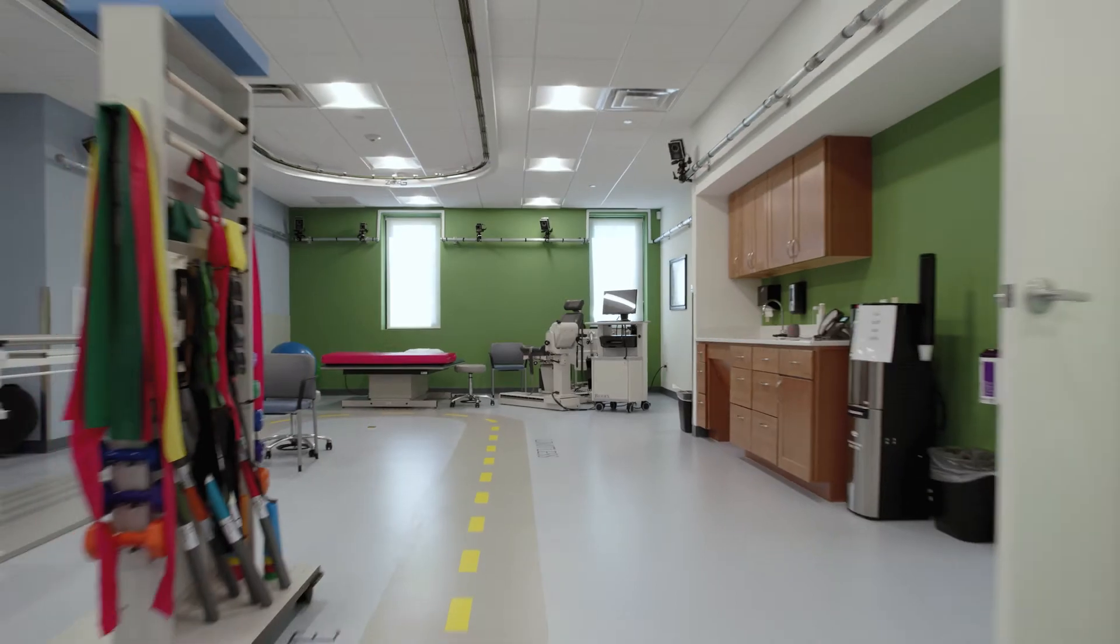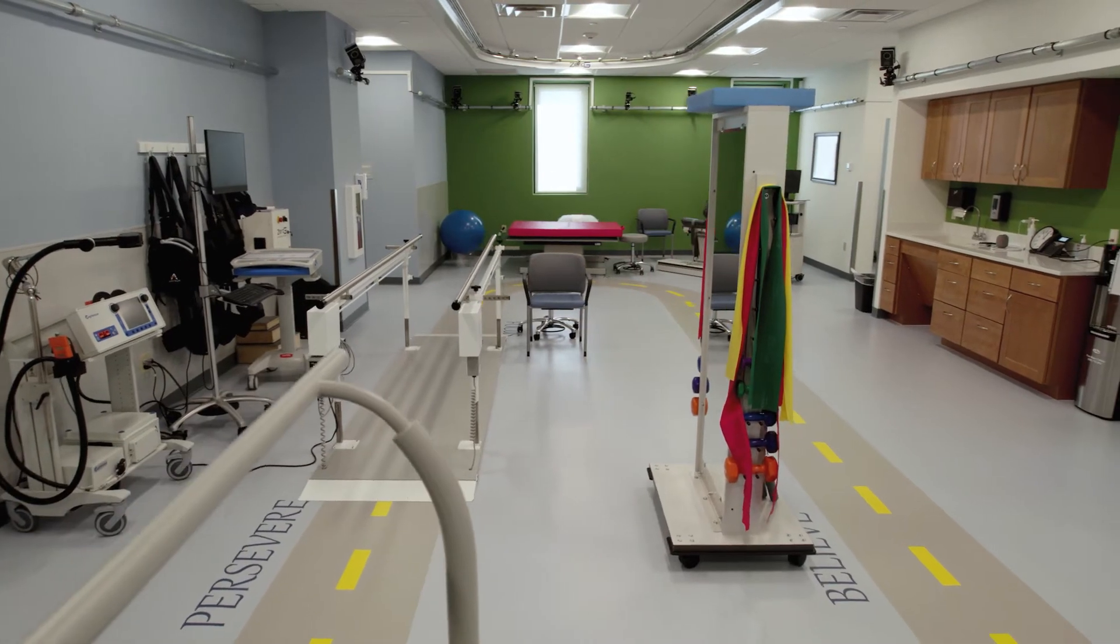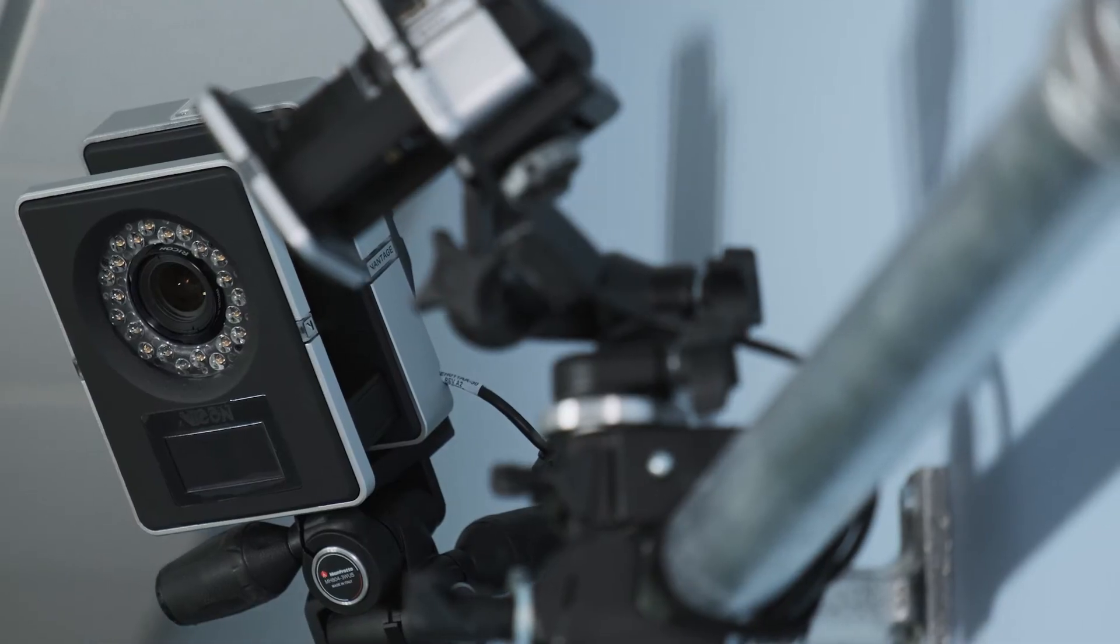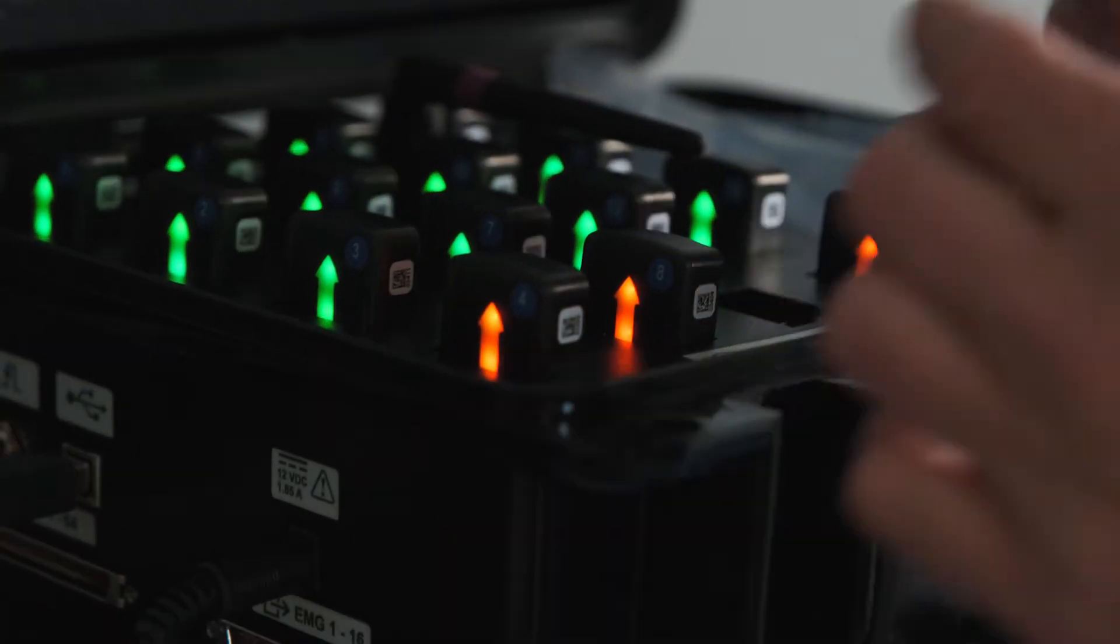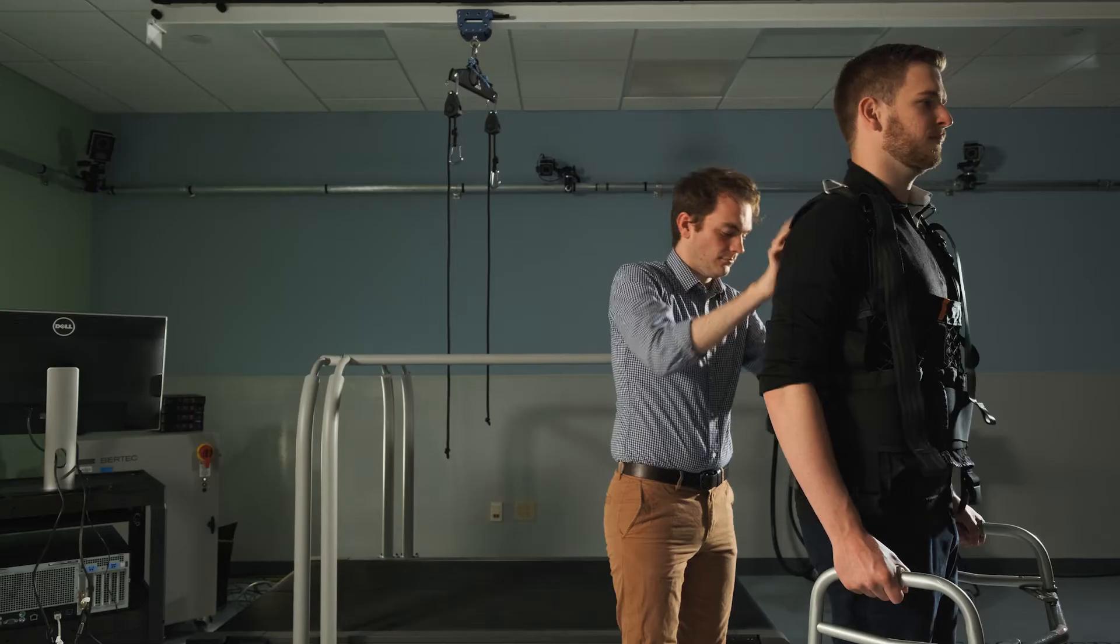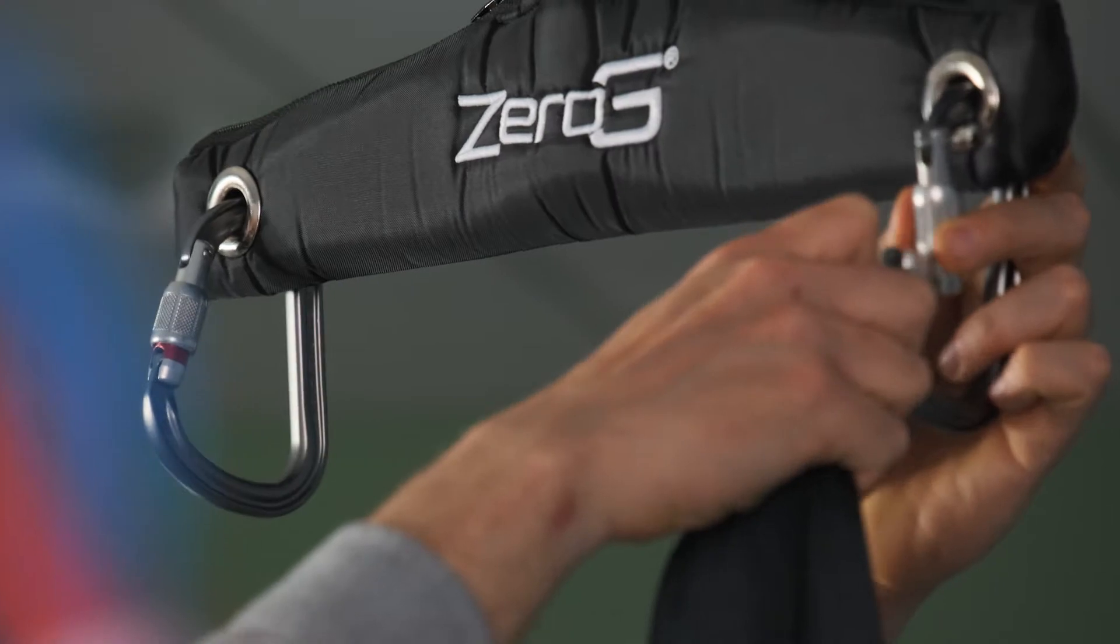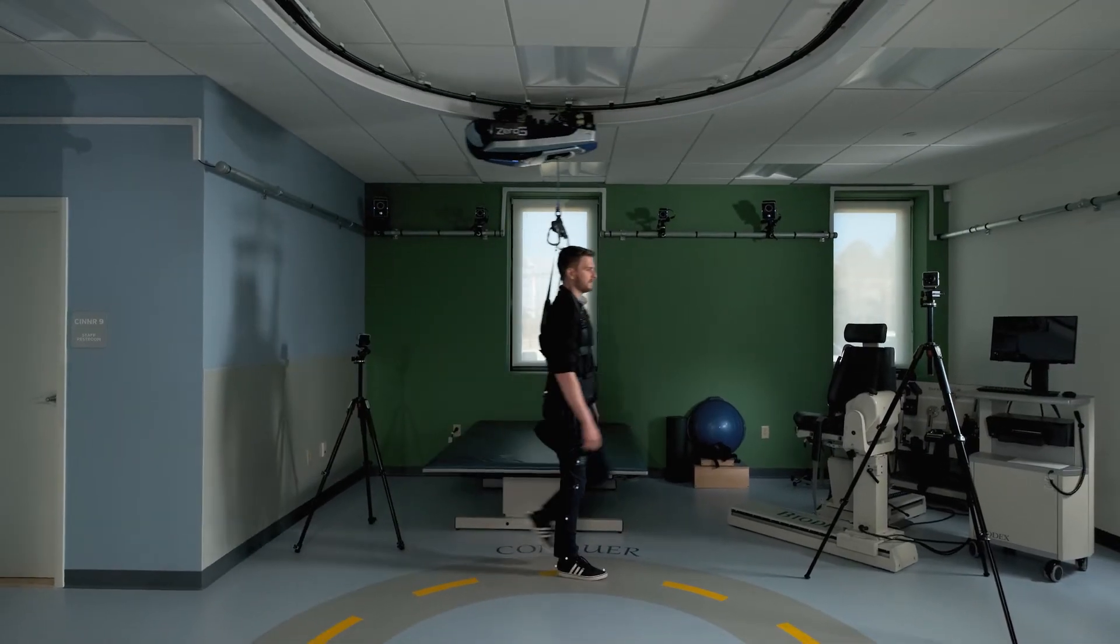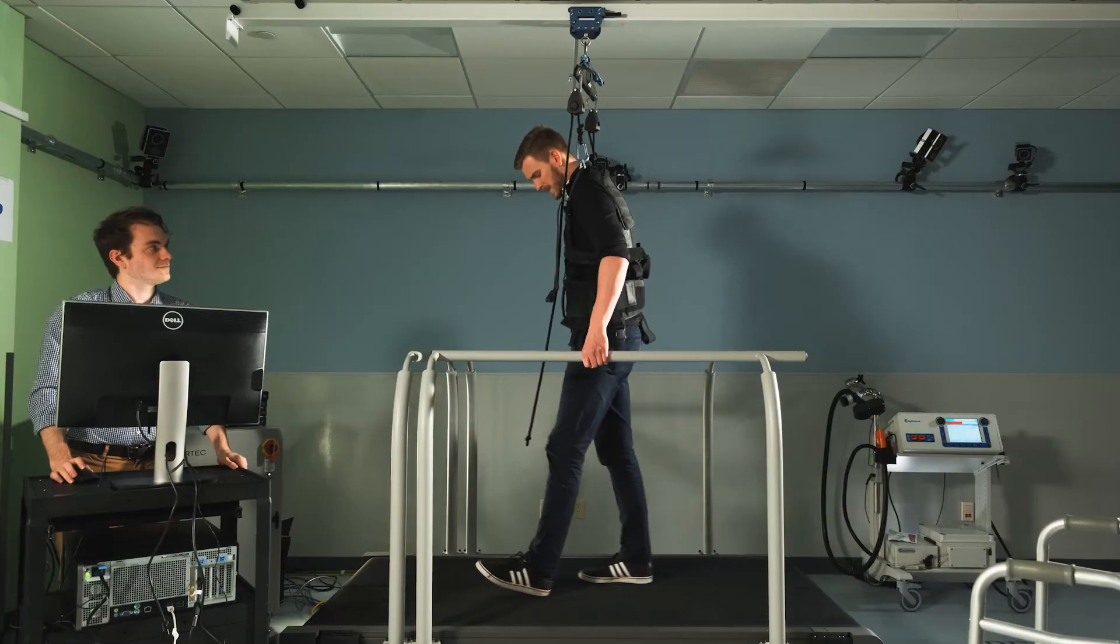The CENR space consists of our large physical therapy gym, as well as multiple pieces of machinery and computers. We have a state-of-the-art camera system that we utilize for assessing patient motion in various applications, as well as a zero-G harness system that enables patients with spinal cord injury to ambulate and physical therapists to be able to work with them.